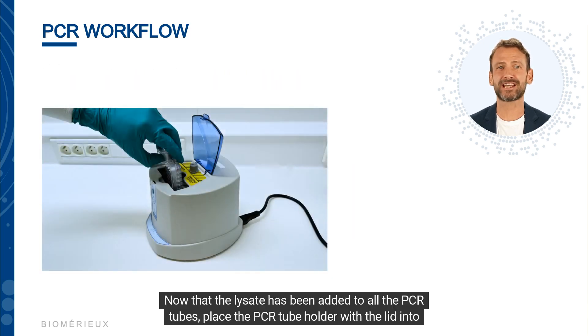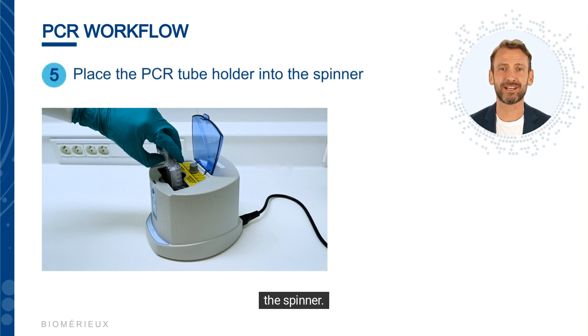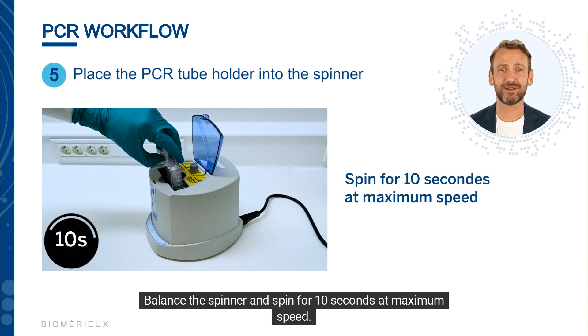Now that the lysate has been added to all the PCR tubes, place the PCR tube holder with the lid into the spinner. Balance the spinner and spin for 10 seconds at maximum speed.